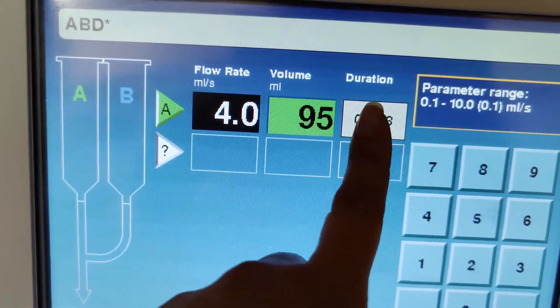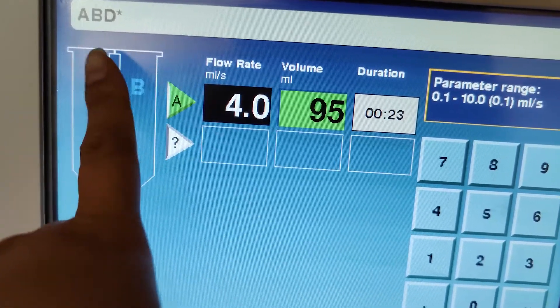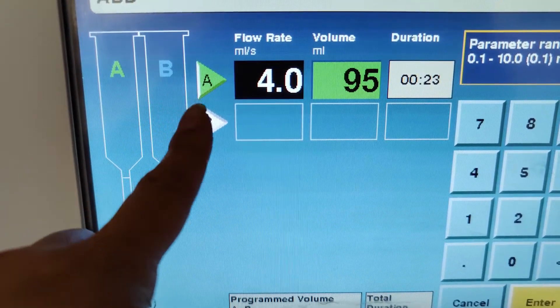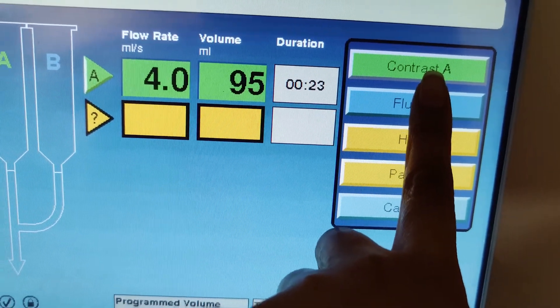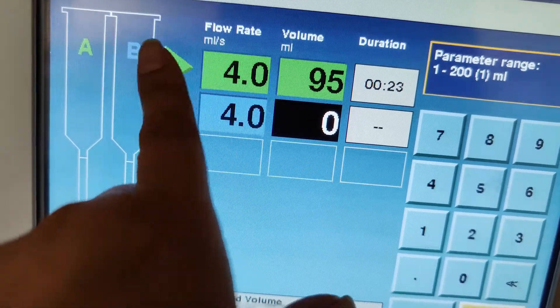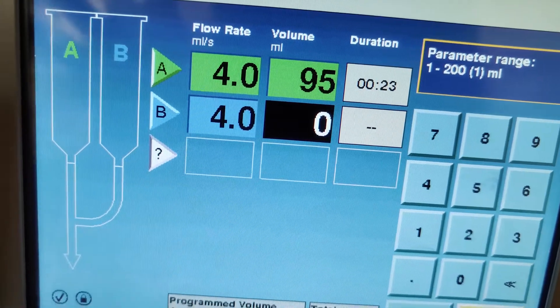For arterial, you want to play around with longer studies and just average this out to your scan time. Sometimes people have the dual syringe where it has the flush afterwards. So the first syringe would be the contrast and the second one — flush B — you just press this. When you're using the flush, you give less contrast because the water will help push the contrast into the body. But sometimes you don't have that, so it's just regular contrast.